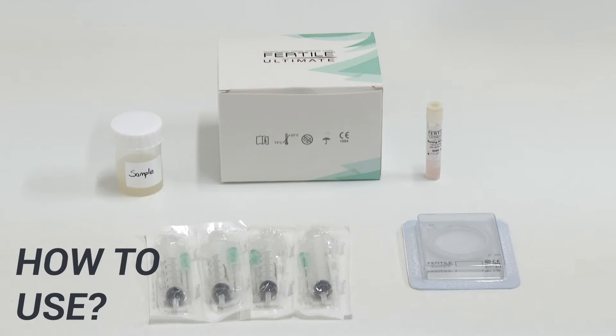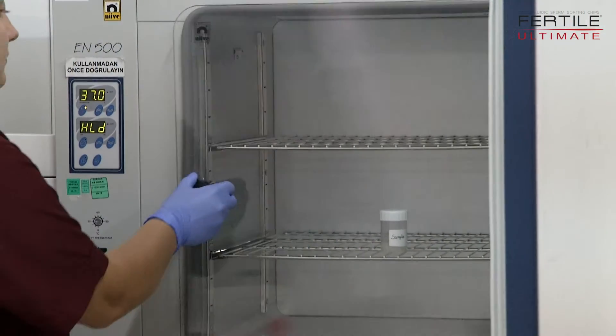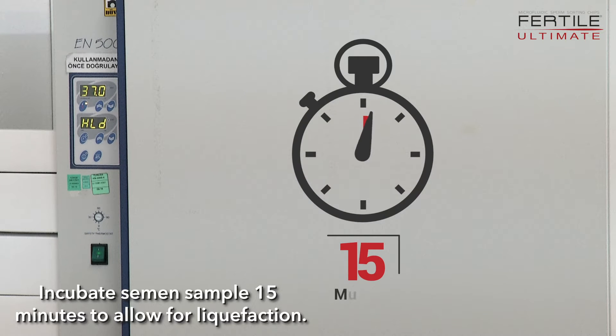Fertile Ultimate. Incubate the semen sample for 15 minutes to allow for liquefaction.